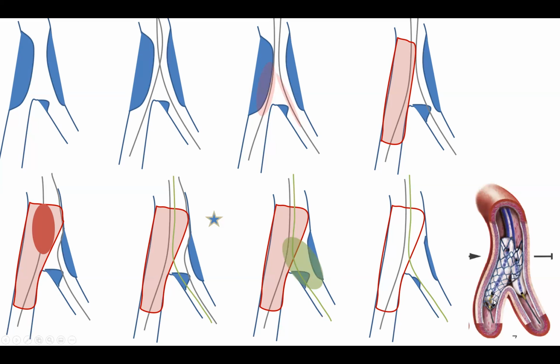So size to the distal stent, plus that balloon, you do kissing balloon. You try to align the dots so that you get a proper and symmetric expansion in the overlap area, and actually try not to overlap them too much in the main branch vessel, because they can create an oval deformation of the main branch stent.